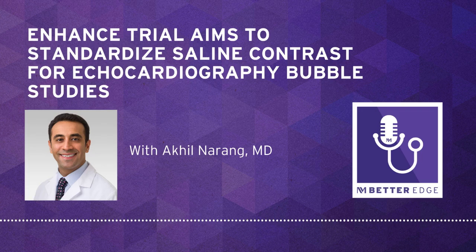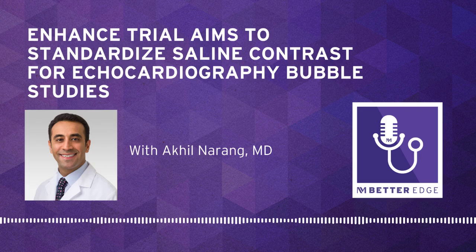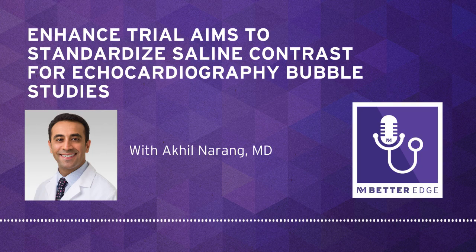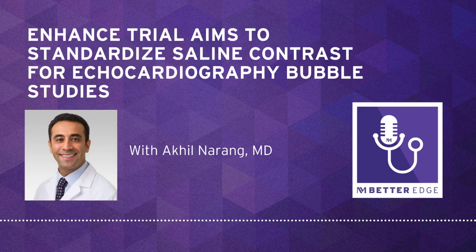So patients undergoing a clinical echo exam where a saline contrast study is clinically indicated, such as for evaluation of intracardiac shunts or detection of ASDs or PFOs in the setting of unexplained strokes. These are patients that are involved or could be recruited for the study. This could be in inpatients or outpatients. We're limiting this to adult-only patients who are also of non-pregnant status. And so these are the patients that are already coming into the echo lab for a saline contrast study, and from that patient population, we can recruit them into the clinical trial.